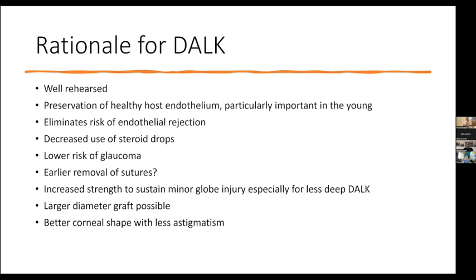Now, if you are preserving the host endothelium, then it eliminates the risk of endothelial rejection, and it will decrease the use of steroid eye drops, which is one of the reasons for an incidence of glaucoma following penetrating keratoplasty.